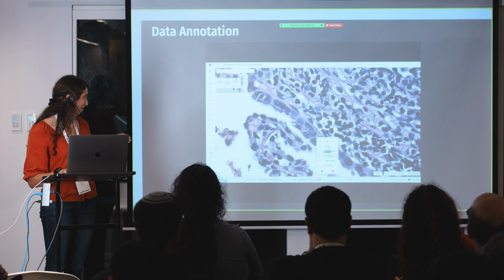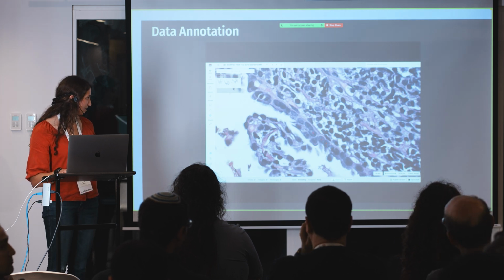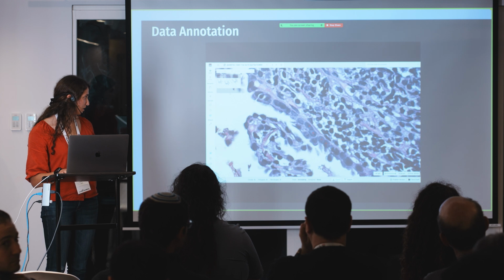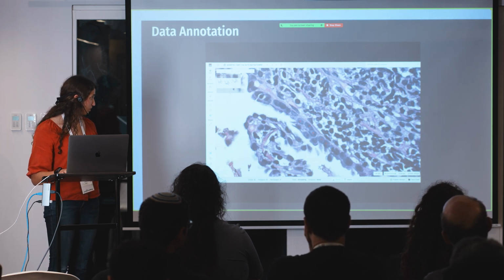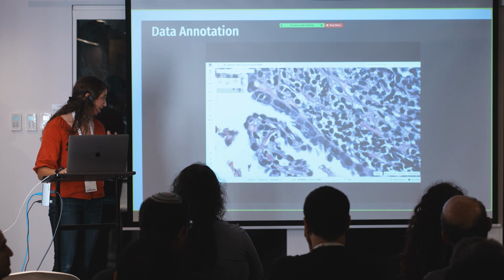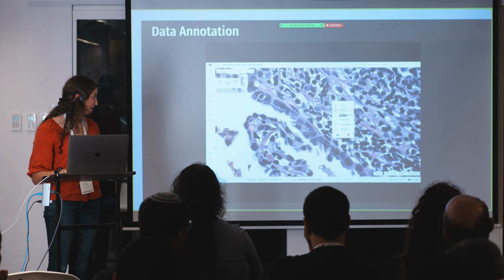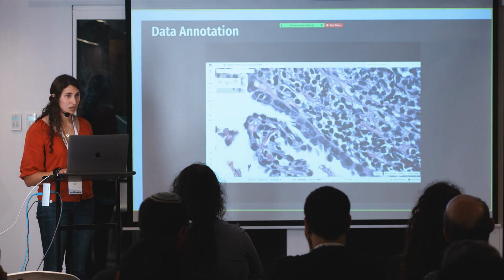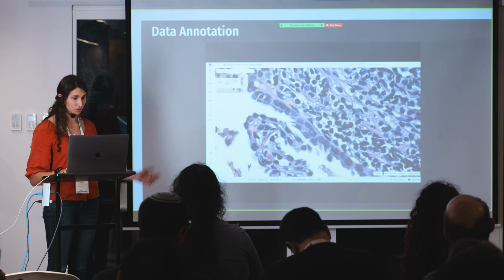So now you have the POV of an annotator here at Nucleai. And you can see that this is a very time-consuming and laborious process. It requires expert knowledge, and annotators are required to go one by one to identify certain cell types based on their morphologies, based on colors. And we'll discuss a lot more about annotations throughout the lecture, but it's important that we understand the difficulty and the pain points that arise with this step.